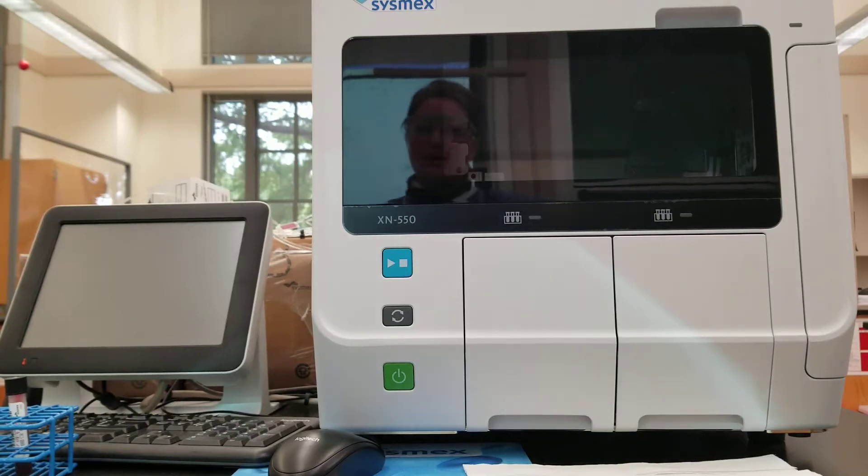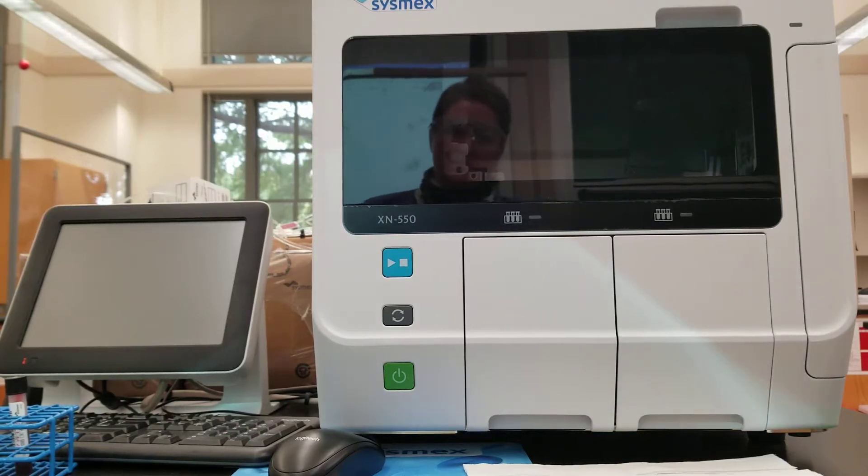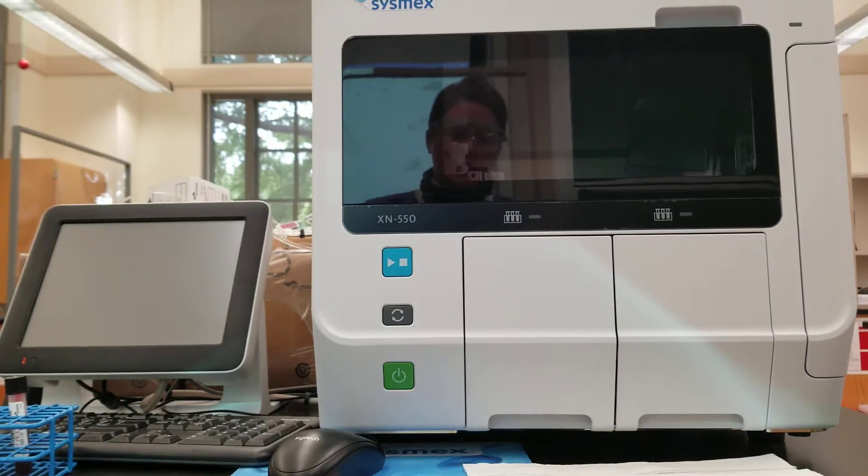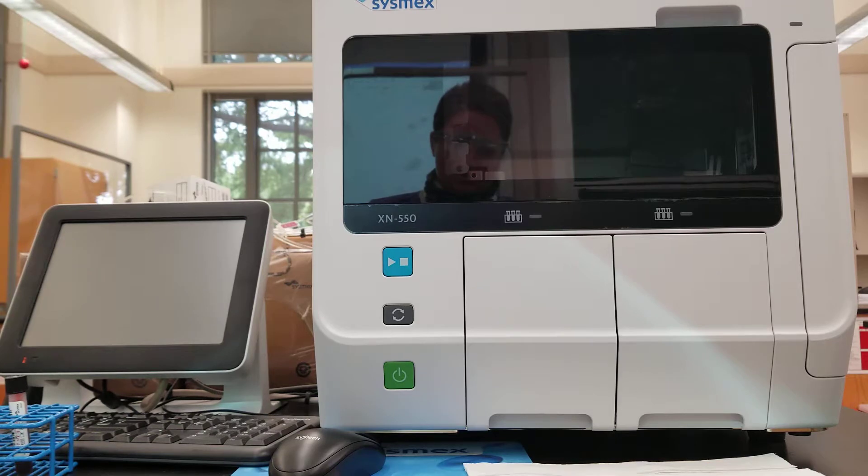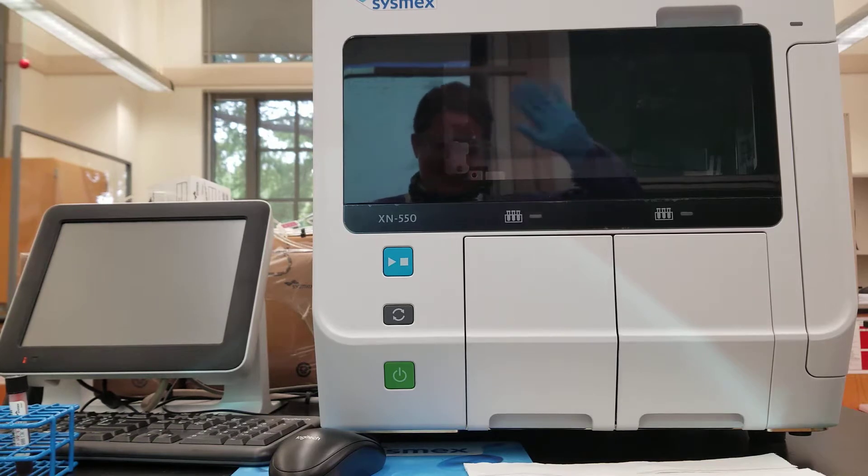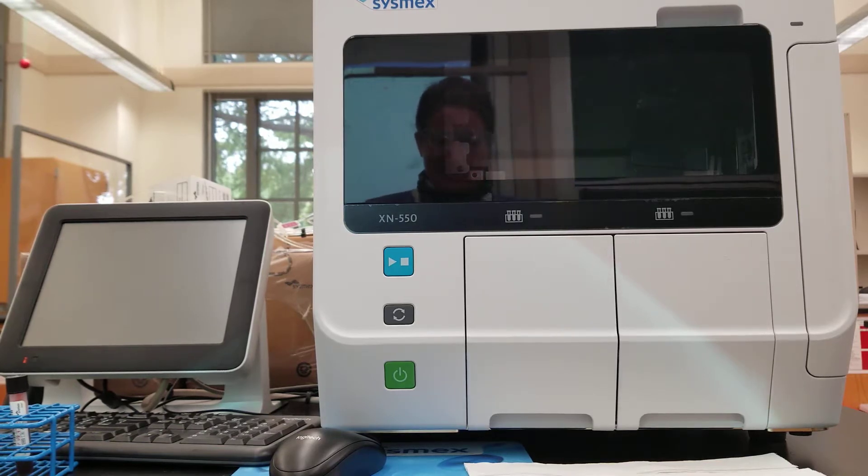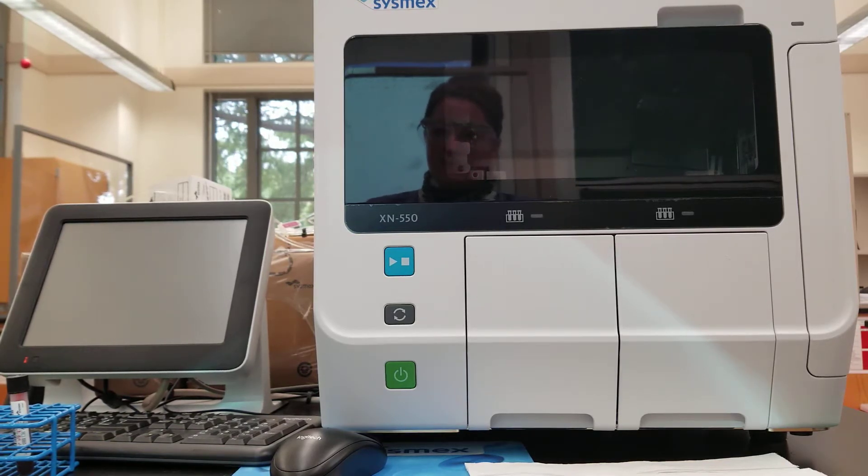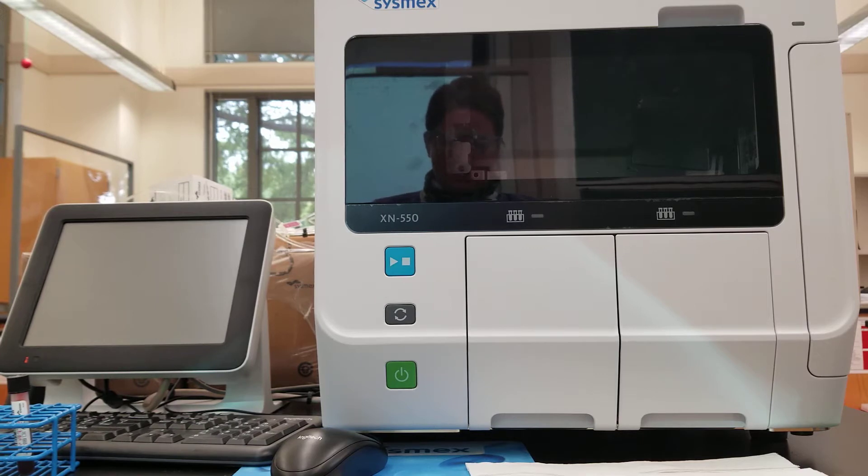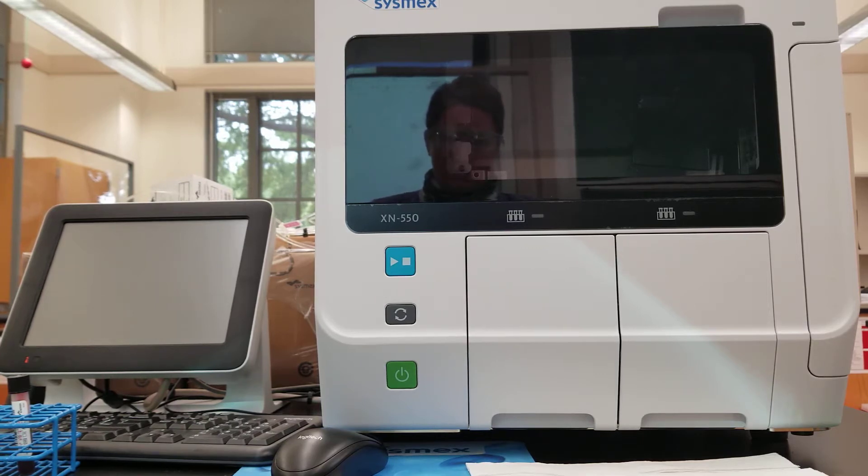Today we're talking about the MEXXN 550. This is our automated analyzer in the hematology lab.